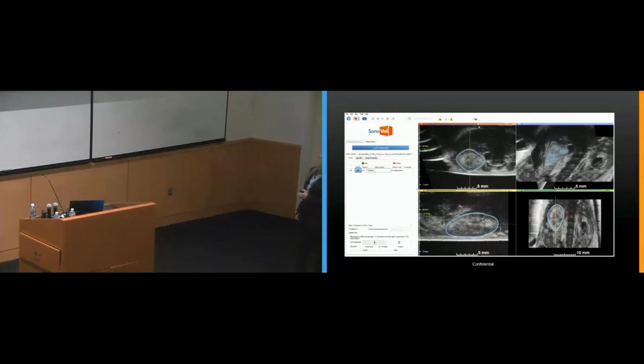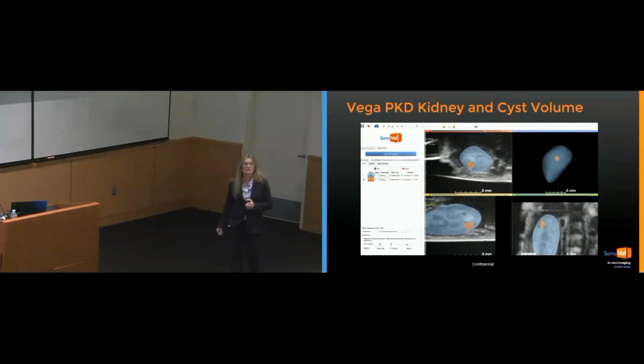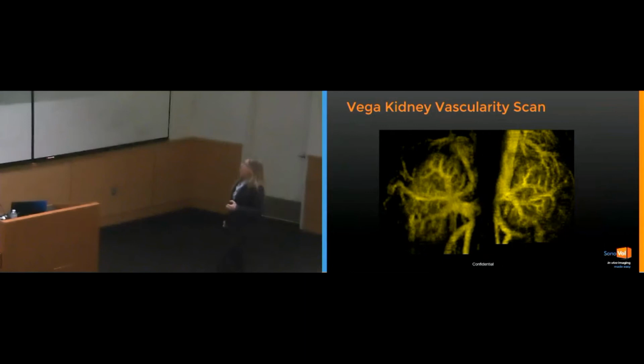And then next, you can of course also segment your cysts, because it's interesting in this disease, the cysts appear and the cysts disappear, and they want to monitor them longitudinally, so we can segment them out as well. And then we can use the vascular contrast to look at perfusion of the kidneys. One other advantage over conventional ultrasound is that both kidneys are in one field of view. So you don't need to scan the left kidney first and then the right or vice versa. You can do it in one scan.